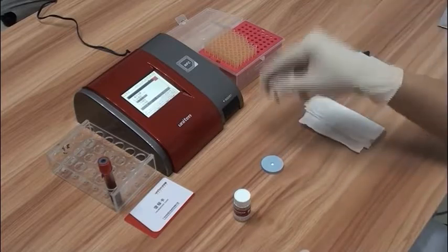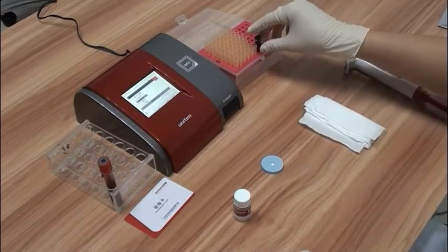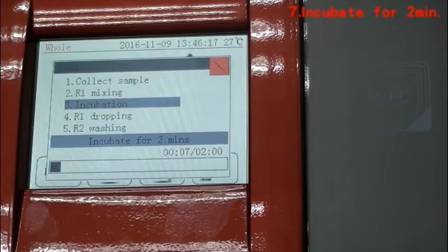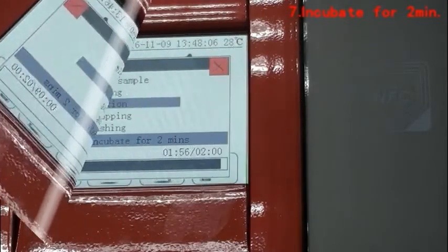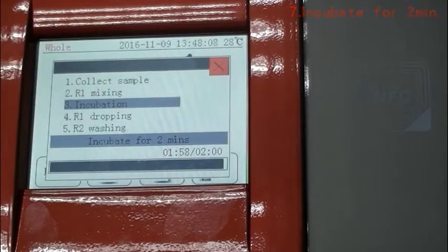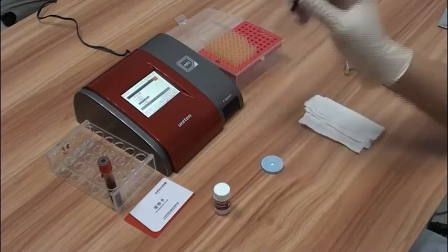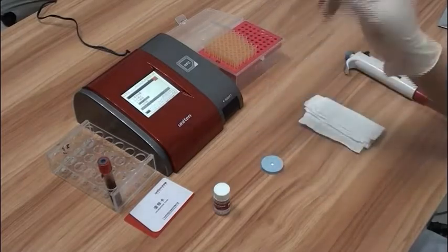After the mixture has been mixed through the lid, place the R1 reagent test tube vertically and incubate for 2 minutes. Once incubation is completed, shake the R1 reagent test tube again.